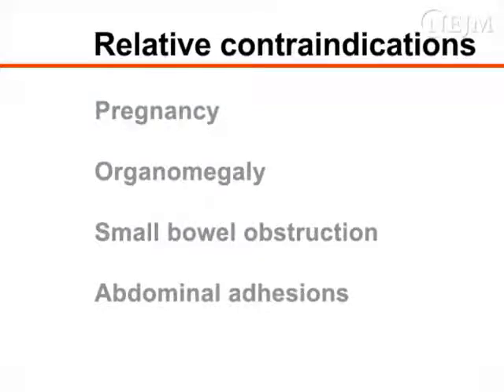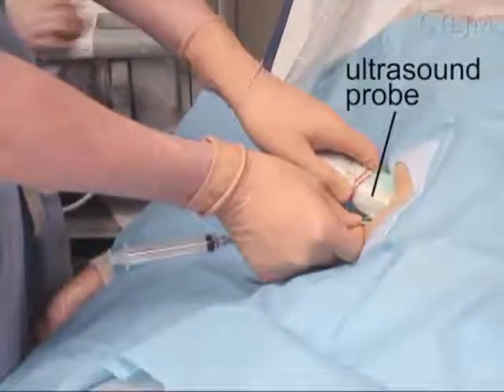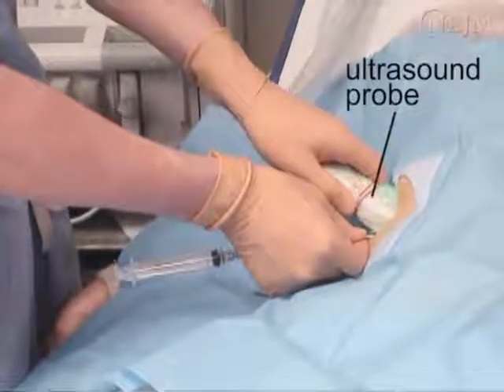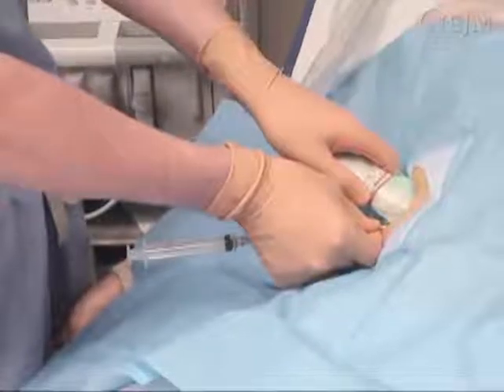The paracentesis needle should not pass through sites of cutaneous infection, visibly engorged subcutaneous veins, surgical scars, or abdominal wall hematomas. Extra caution should be used in pregnant patients and those with organomegaly, small bowel obstructions, or when available, ultrasound guidance should be used to minimize the risk of intra-abdominal organ injury, especially in patients who are overweight and those with multiple surgical scars.